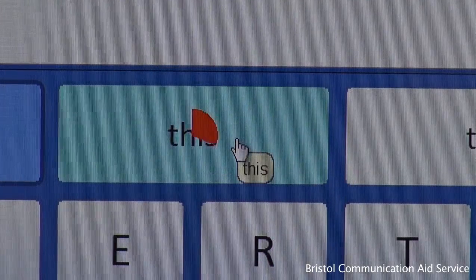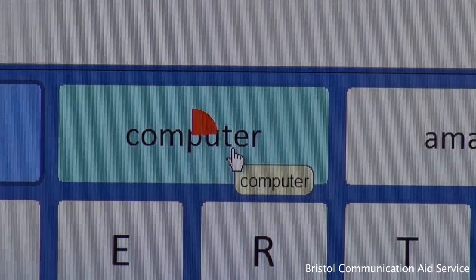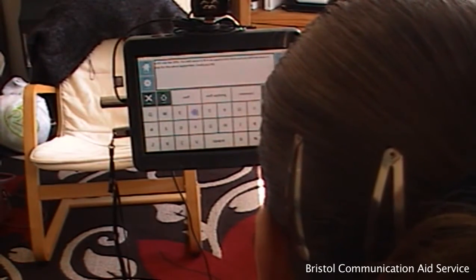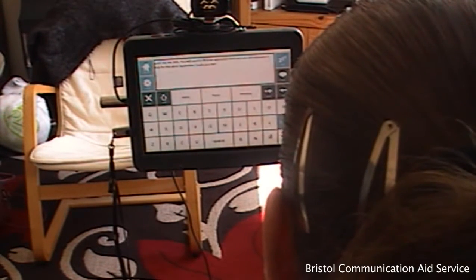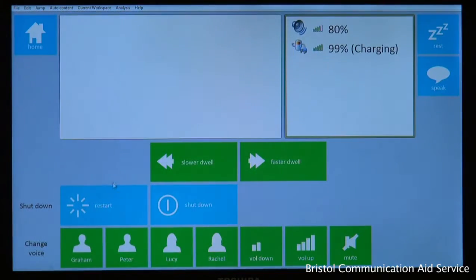Are you finding the dwell is taking too long, or selects an option before you're ready? Do you feel the tracking movements for controlling the cursor could be made more comfortable? Taking the communication program Fast Talker as an example, changing dwell timing is achieved by entering settings, which can be accessed by the user independently.